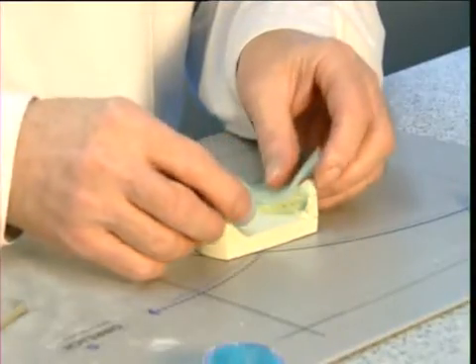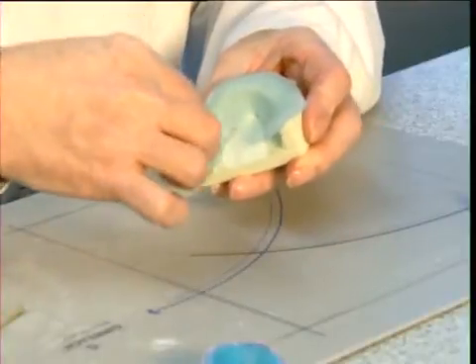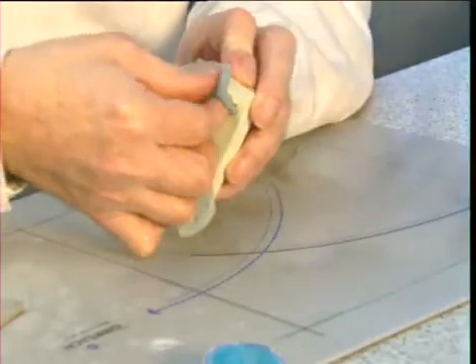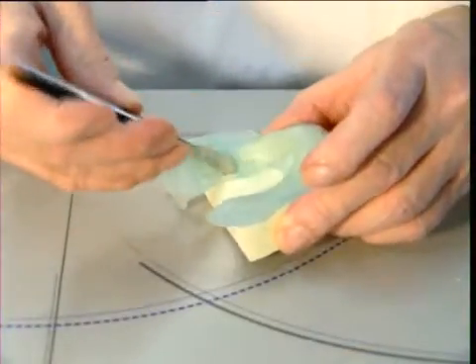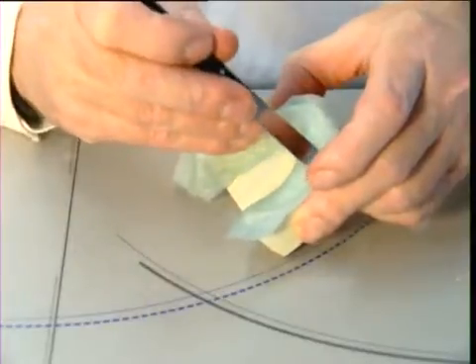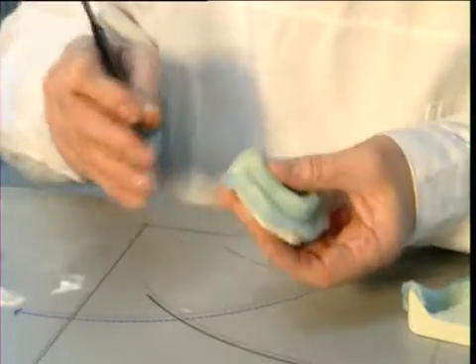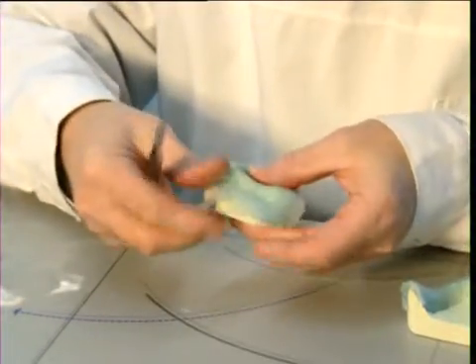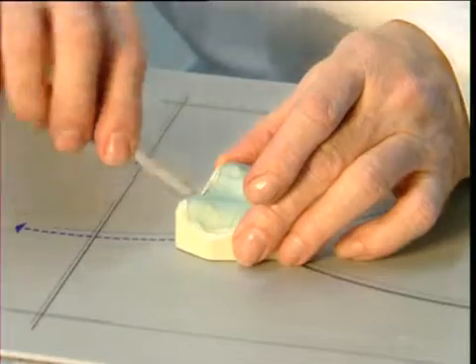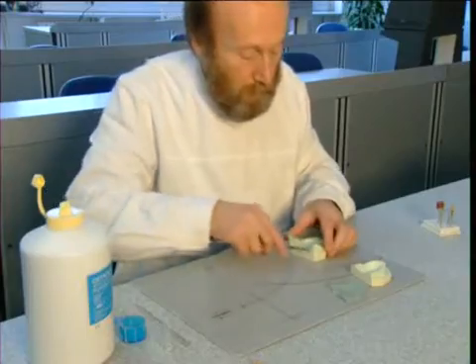Press the flexible tray form onto the model. Adapt the peripheries and cut off the excess material. Allow the material to cure for approximately 7 minutes before cleaning the special tray.